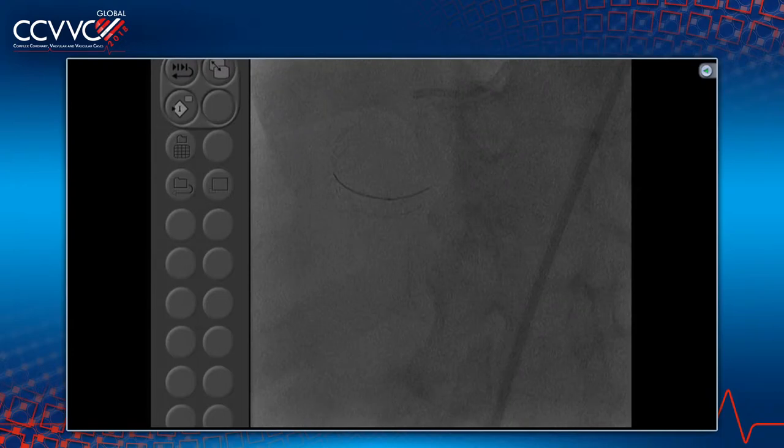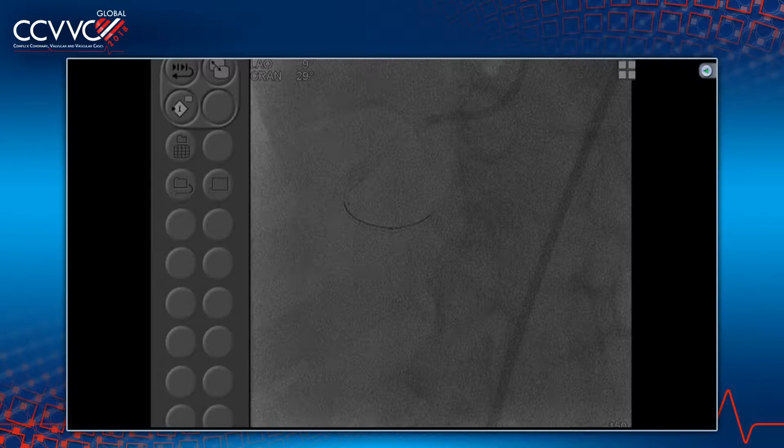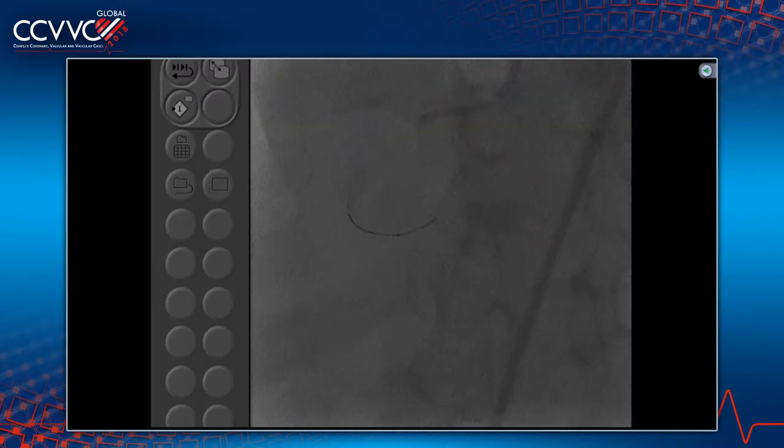There is a detail there: there is a stent in the distal vasculature, which doesn't seem to be very short either. So somehow that vessel, once upon a time, was able to be navigated and even have a stent deployed in the distal branch of the RCA. In general, that's somewhat encouraging, although it's a bit far from where the CTO starts.